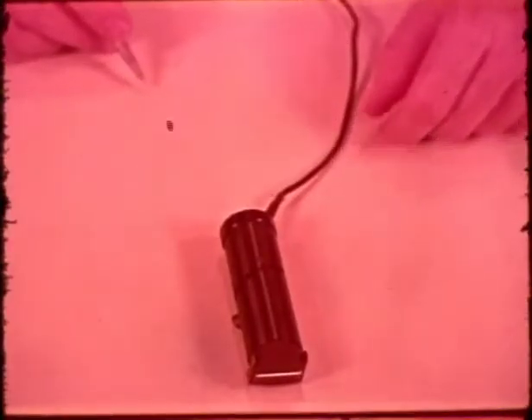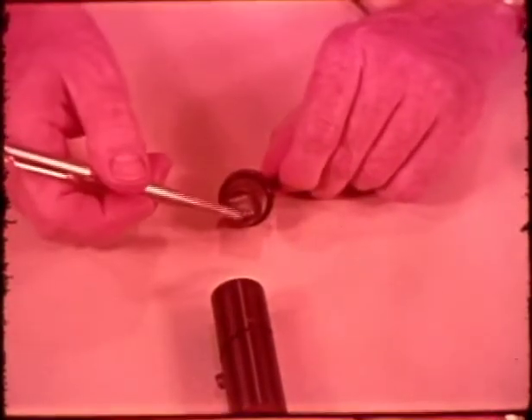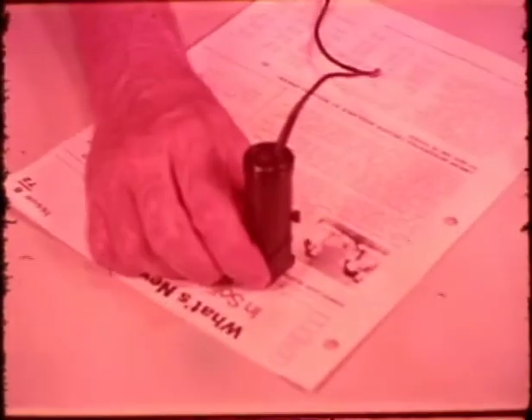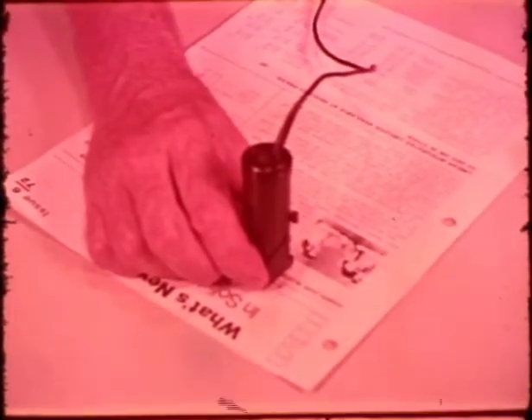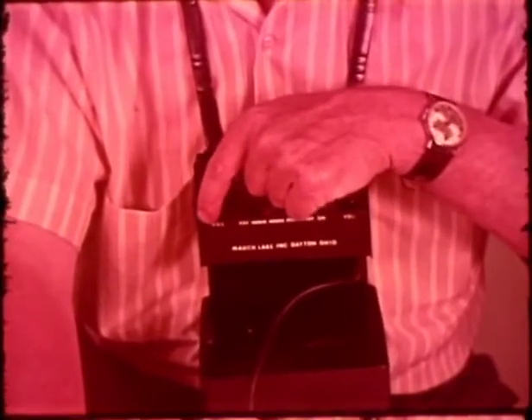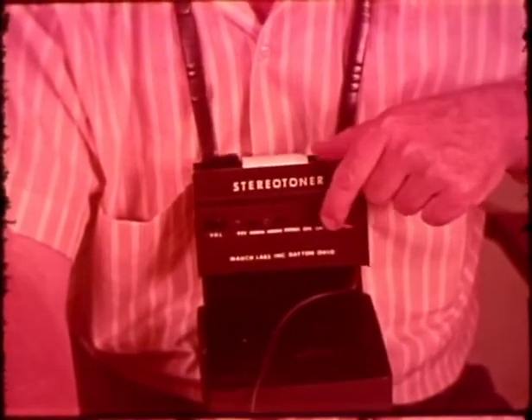The top part of the probe is an assembly which contains the photocell array, sealed under glass, and the lamp brightness control. The cable from the probe leads to the Stereo Toner control box. The controls on the box are three slide switches: one for power on-off, one for monaural or stereophonic output, and one for normal or reverse print — that is, light letters on a dark background — and two volume controls, one for each of the two earphones.